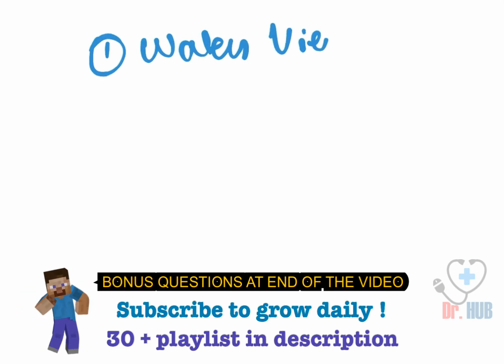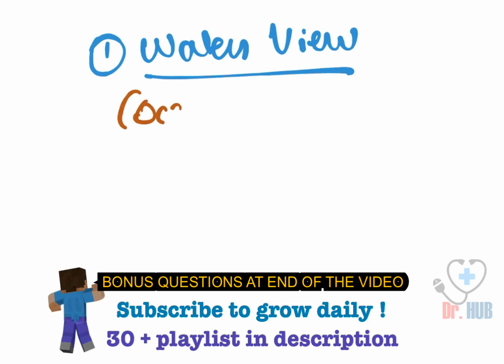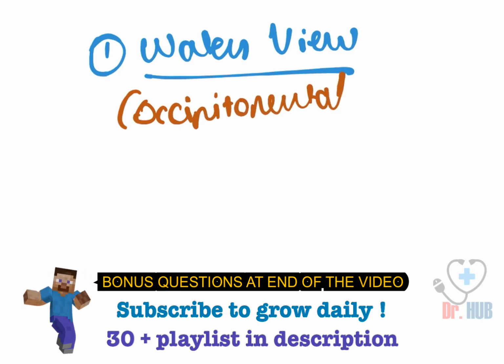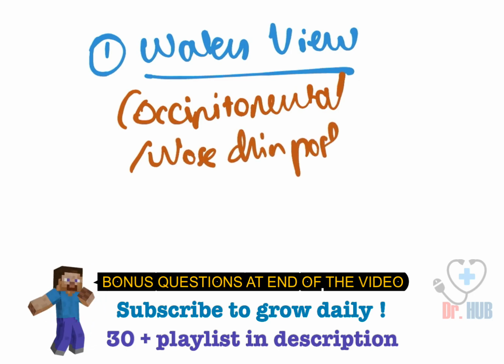So first, we are going to look at the Waters view. So the Waters view is nothing but the occipitomental, or the nose chin position view.